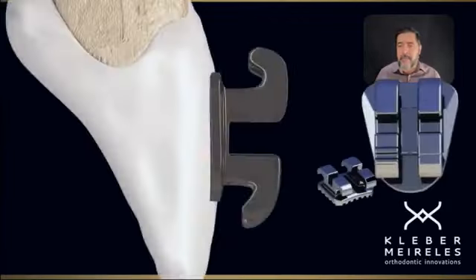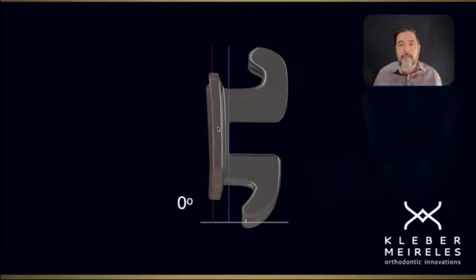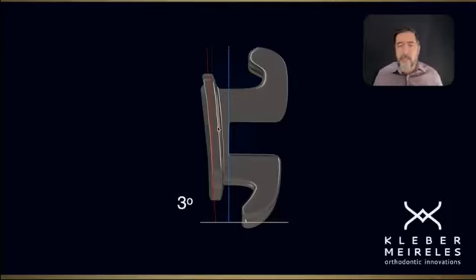0 is the standard. 0 is the edgewise, non-programmed bracket, meaning we have the bottom of the slot parallel to the wall. The bottom of the slot, this wall here, is parallel to the base of the bracket. And if I have embedded prescription of inclination, I'll have this condition changed, like this, for example. If I have a different set of pre-programmed brackets, I'll have 3 degrees or 7 degrees. I can have many different inclinations.